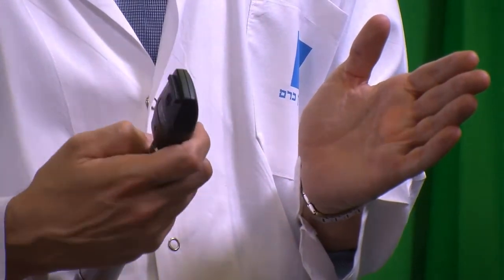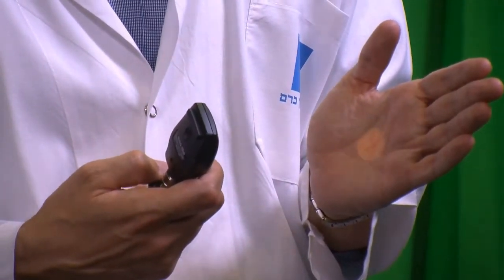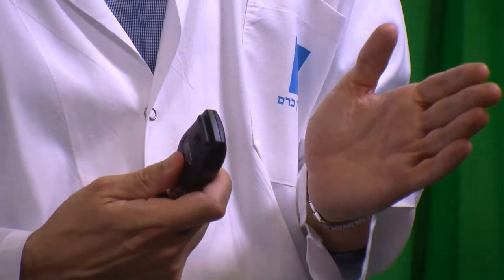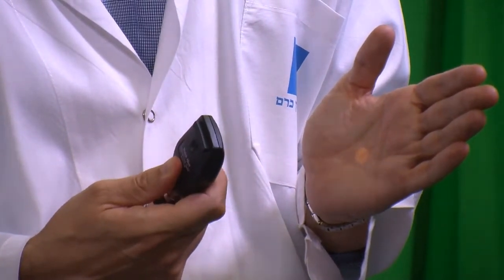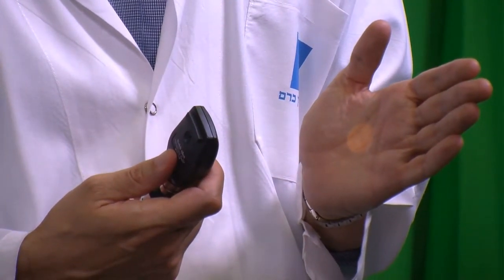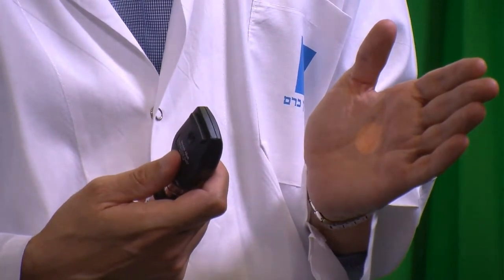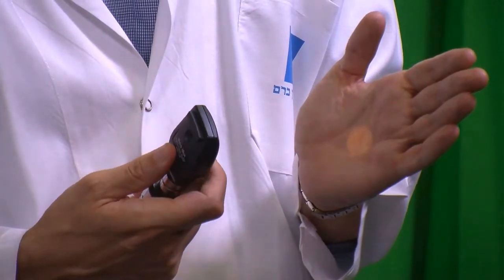And in this video that we're doing together, we're going to demonstrate my tips for using a direct ophthalmoscope to successfully examine someone. Okay, I've turned on my direct ophthalmoscope and I have a circle of white light here. The ophthalmoscope has different settings, but it's the circle that I'd like, and you have different sizes of circles. It's believed that it's appropriate to use a circle that's small enough to match the patient's pupil size. So I have my circle set up.